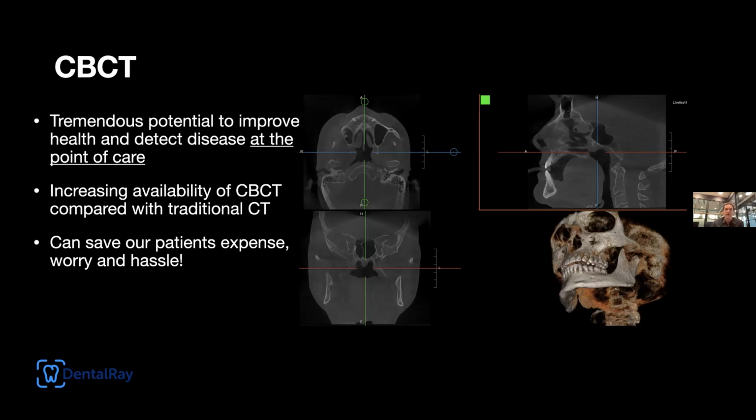So another little story is that one of our dental colleagues had a patient, and he had obtained a Panorex, and he saw what he described as, quote, something in the maxillary sinus, but didn't know what it was. He had a cone beam CT scanner, but there were concerns, as Garry and Eliot brought up: do I absorb this cost in my practice? How do I talk the patient through the radiation dose? Is this going to result in me seeing things that I don't really want to see, or won't know what to do with?